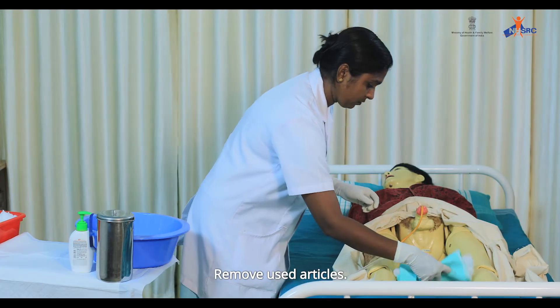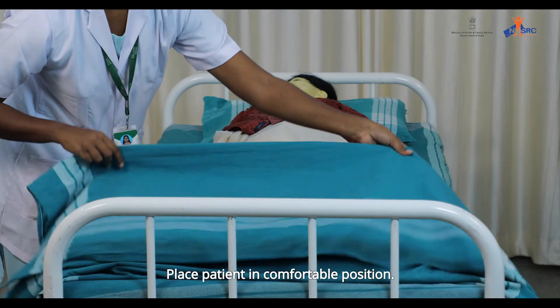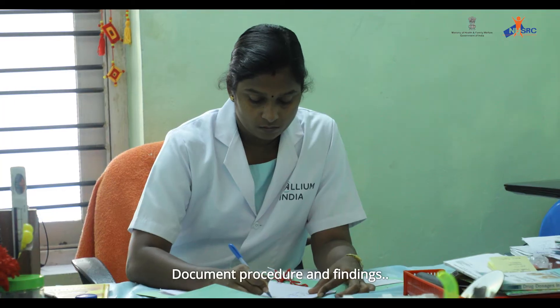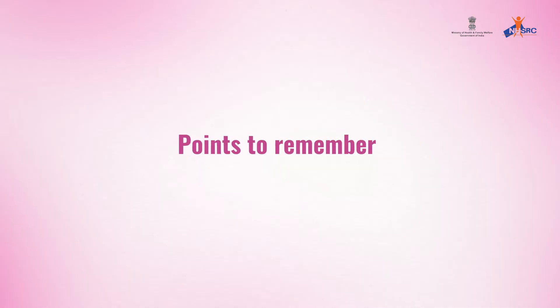Remove used articles. Remove gloves and wash hands. Place the patient in a comfortable position. Document the procedure and findings. This completes the procedure for catheter care in males.